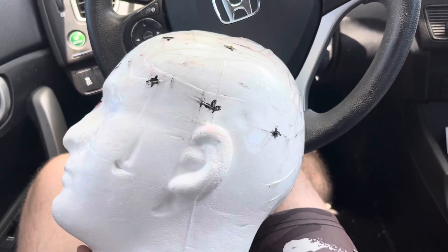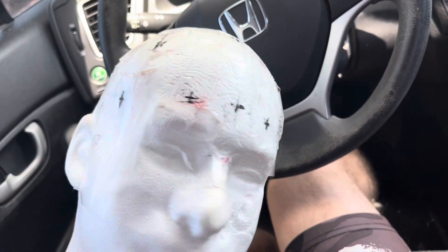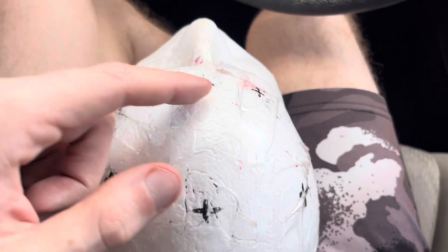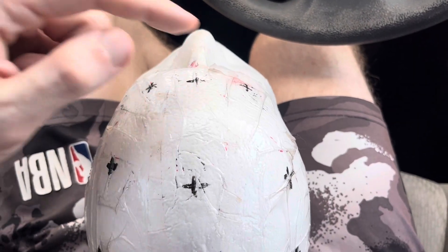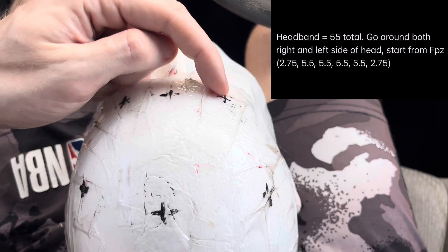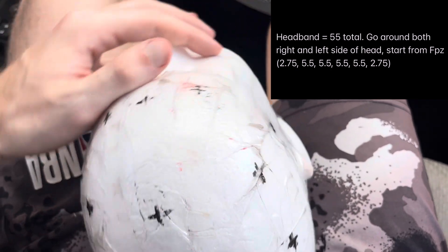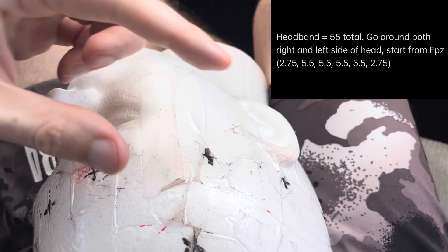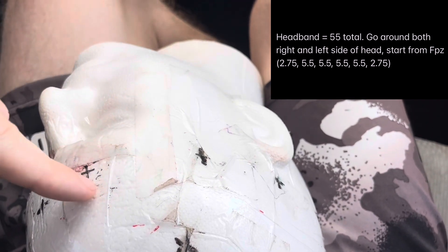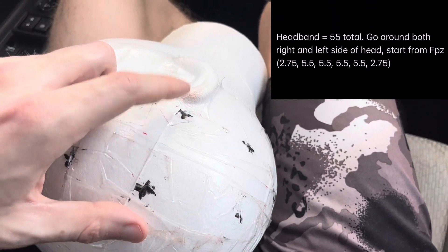The next step is the headband — there are marks going around the head right where a headband would go. Let's say the whole circumference around the head is 55 centimeters. Starting from FPz to FP2 is 2.75 cm — that's a 5% measurement. Then going around the head in a headband, the spacing is 5.5 cm (10% of 55): FP2 to F8 is 5.5 cm, and F8 to T4 is 5.5 cm.